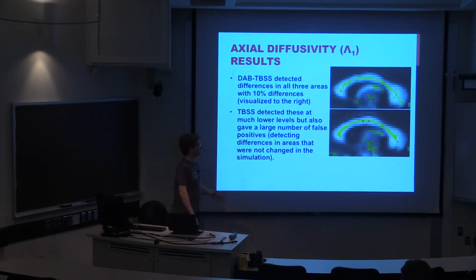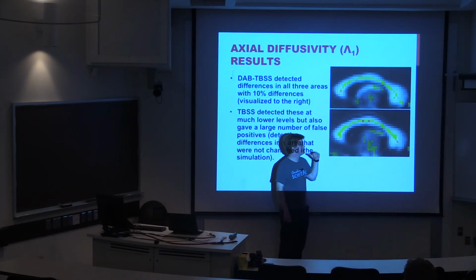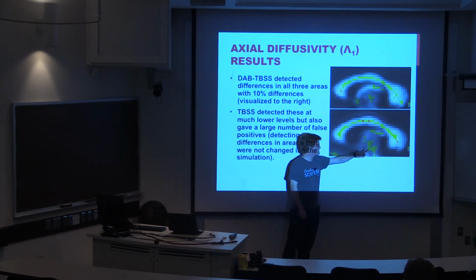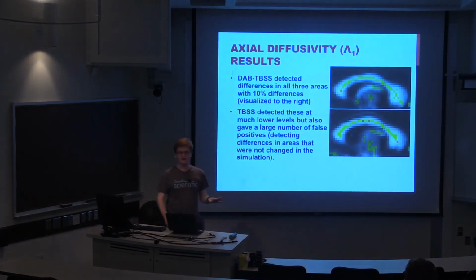I didn't have the visualizations right here, but regular TBSS was saying, okay, I see a difference here, here, which wasn't even simulated, period. So if a physician were using that, they would end up coming up with a completely wrong conclusion. Okay.